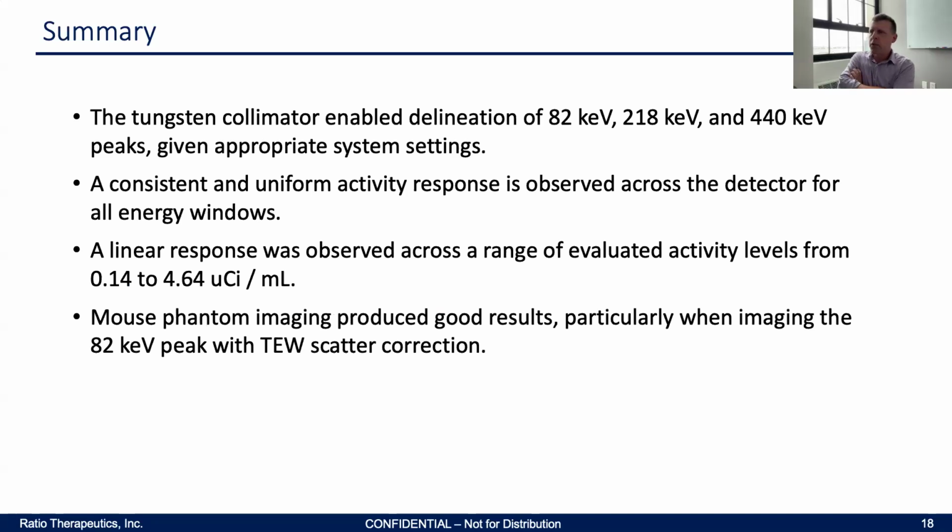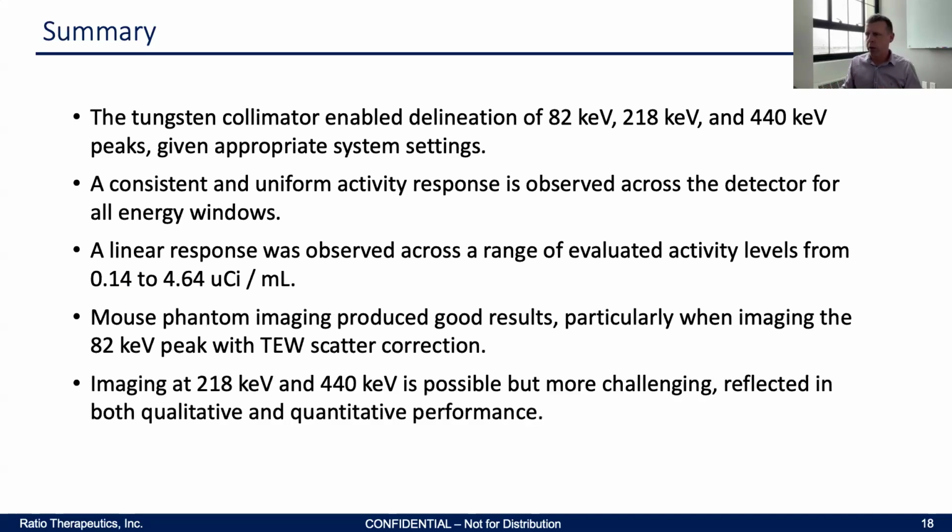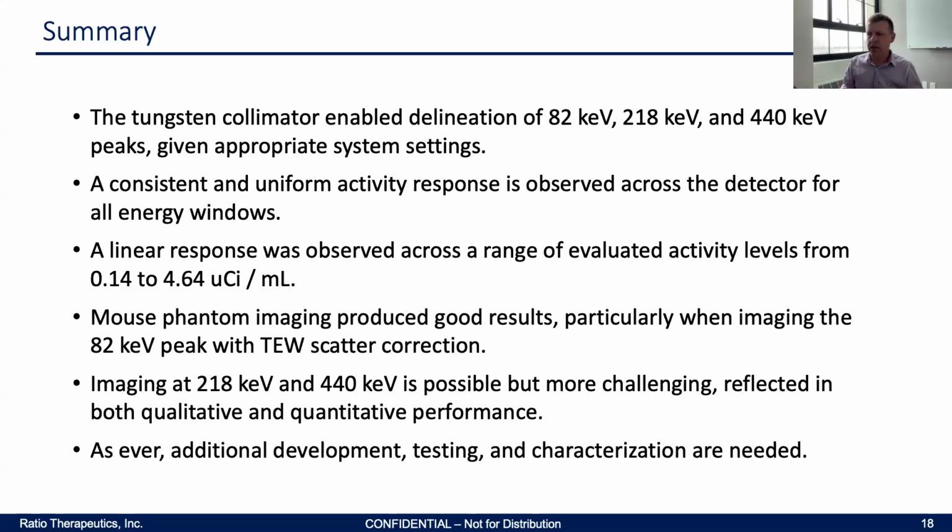The mouse phantom imaging produced good results, particularly when imaging that 82 keV peak with scatter correction. I'd say the other two peaks look encouraging, but we can do a little more work there. So, reflected here, it's possible, but more challenging. And as ever, these are early days, and additional development, testing, and characterization are needed. That's probably an evergreen statement, but it's true here as well.